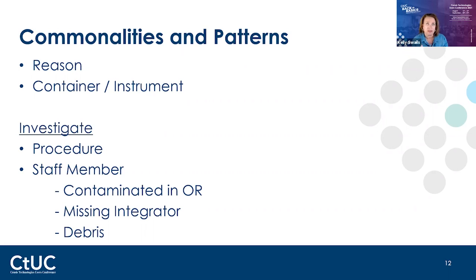I look at it as decontam's always a little tricky. I think of when I take stuff out of my dishwasher at home, I look at it, make sure it's clean before I put it in the cupboard. Well, if you're in decontam, you can't look at it before it goes to assembly because you're on the dirty side.